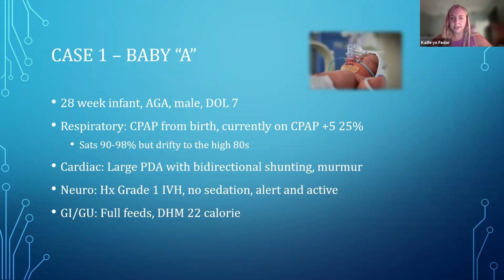And also we just kind of wanted to know, before we introduced this whole project to the staff, is this safe? What are the considerations we need to make with the skin and probe adherence, and does it pick up well on this population and things like that? And I happened to have an assignment in the unit that day. I had a lovely little 28-week infant who was very stable, 7 days old. I said he would be a really great candidate.